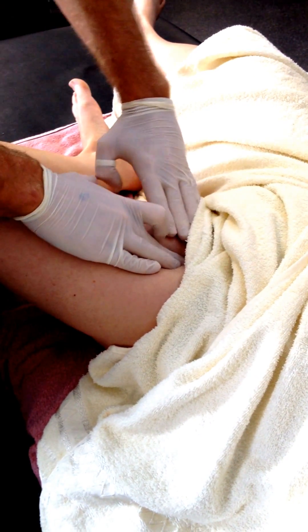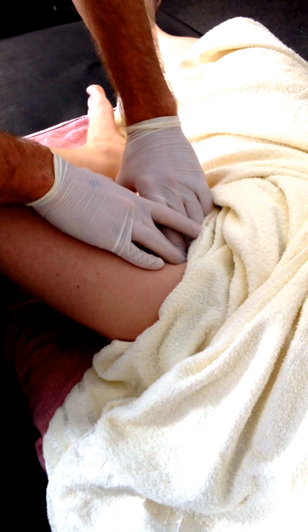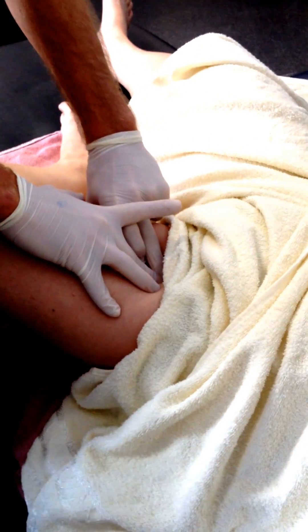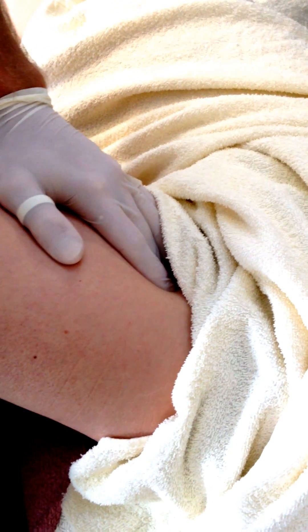If you know it's in through there, before I even go with palpating it, I'll feel for the pulse. Generally where the pulse is, you'll find it will be more medially, sort of closer to pectineus anyway — which is the case here. If I've got my two middle fingers there, I'm feeling the pulse under my left middle finger, and obviously where psoas will be is out over there. So to identify — is it in the deep part, the pectineus? How does it feel? It's more over pectineus, the artery — so it's more medial in the triangle generally. But that's why you always feel for it.